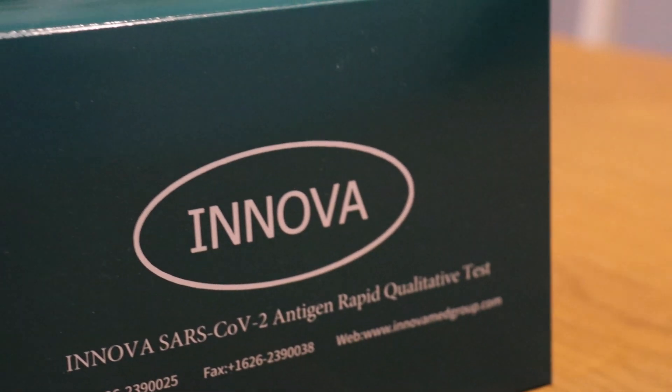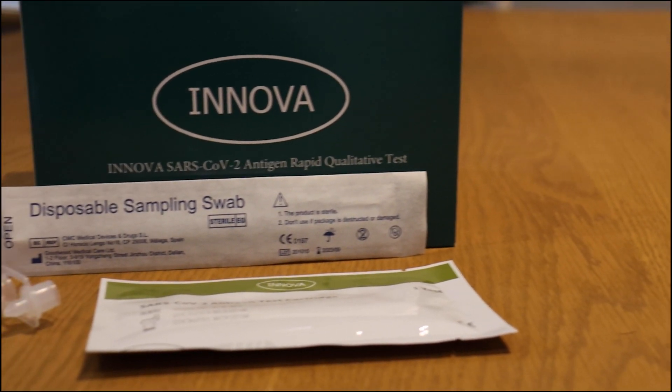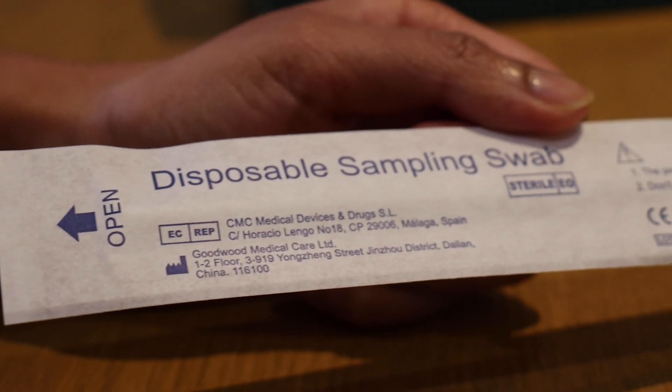This is the COVID-19 testing pack. Yours may look slightly different if it's from a different brand, but they should all contain these four things: the sampling swab, an extraction solution, a dropper bottle, and the testing cartridge.